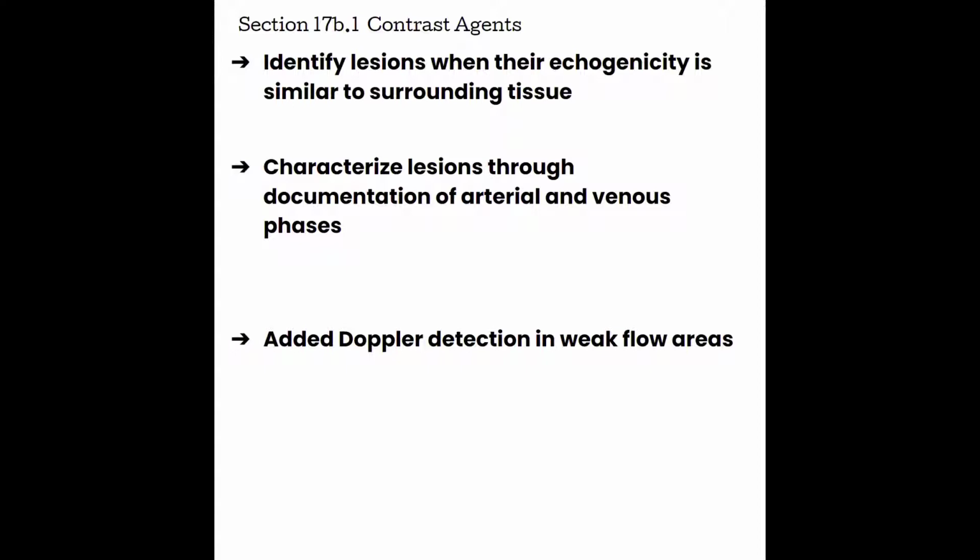And lastly, because the contrast agent is moving anywhere that blood can move, we can actually get a better Doppler signal from the microbubbles that are moving through the blood vessels to get even more information about the velocity and type of blood flow through that area.